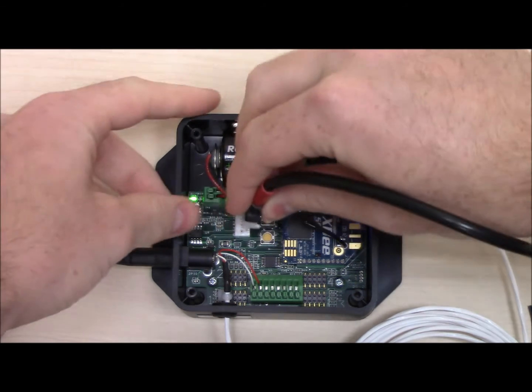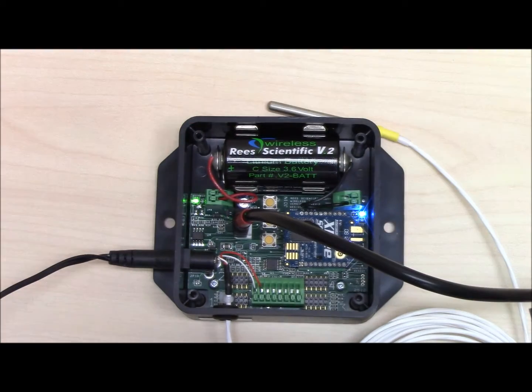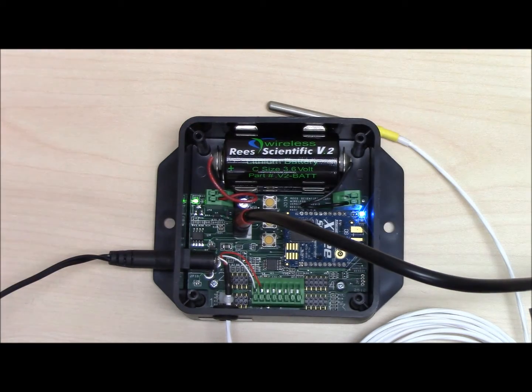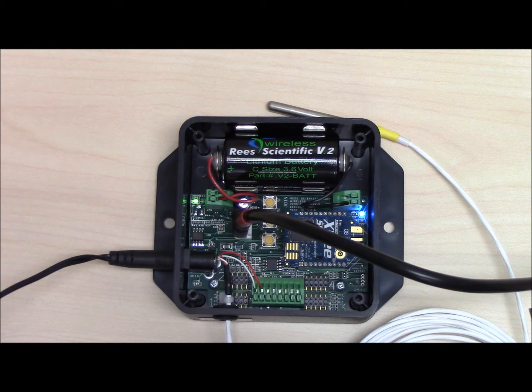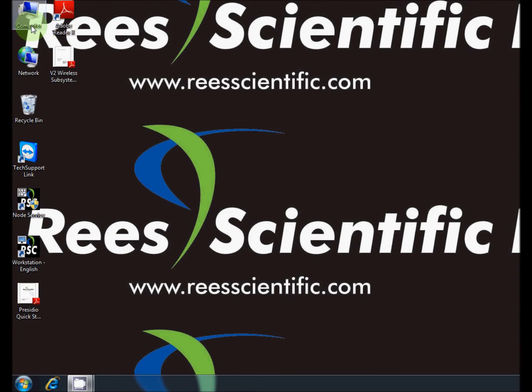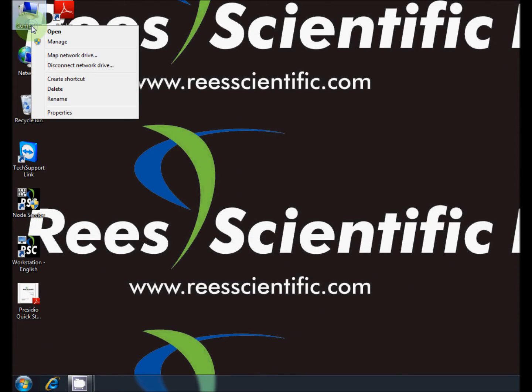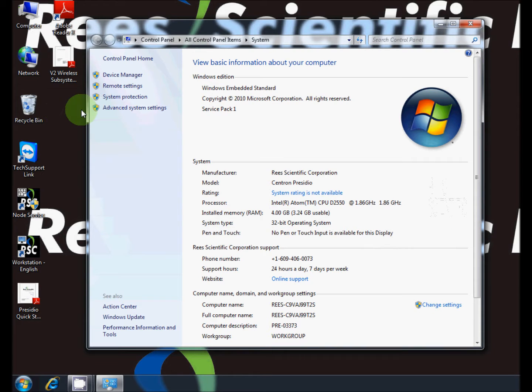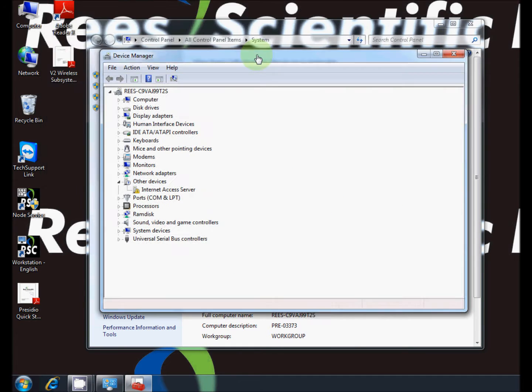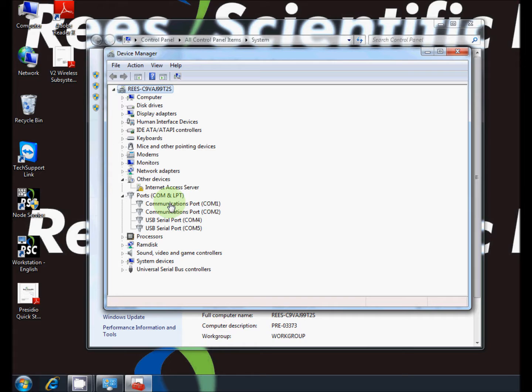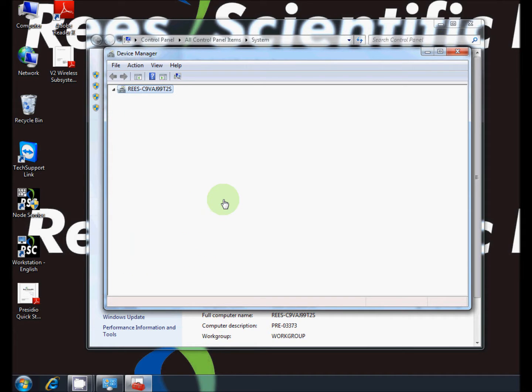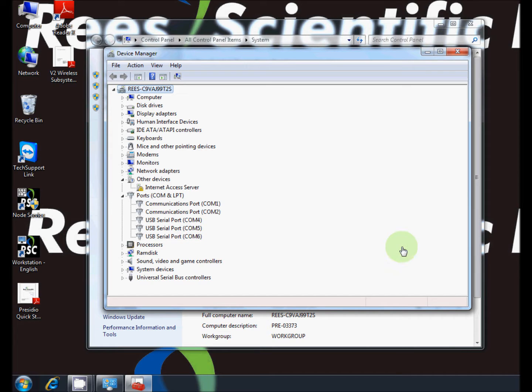Connect the USB programming cable to the 4-pin programming header in the module. Open Device Manager on the computer with Centron software and view the COM ports. Connect the cord to an open USB port and watch the Device Manager to see which COM port is being used. This COM port number will be needed later. In this case, the COM port number is 6.